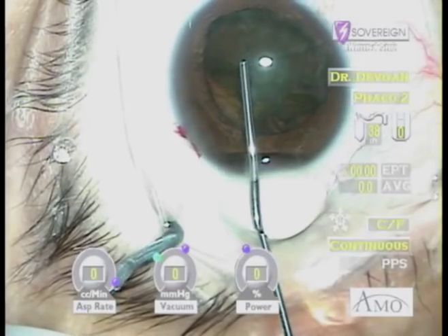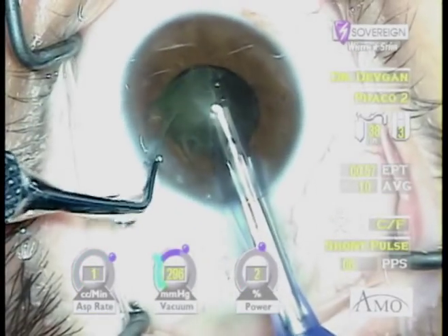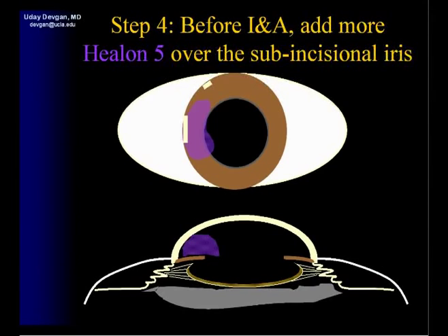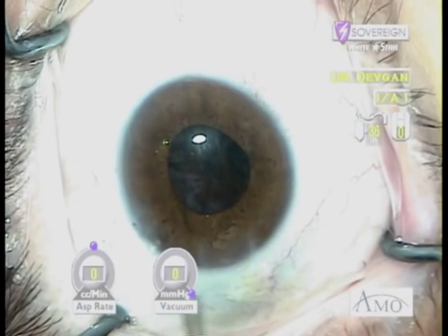By using mostly our traditional viscoelastic we can perform FACO in the technique we're used to. In this case, FACO CHOP with power modulations resulting in very efficient lens removal. We'll add more Helon 5 to form a viscoelastic plug above the iris just prior to the IA.